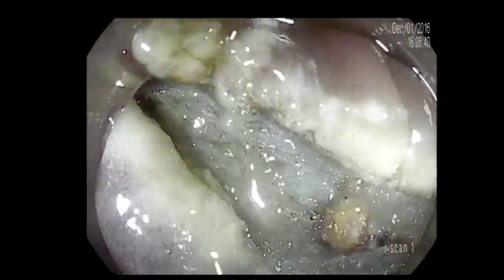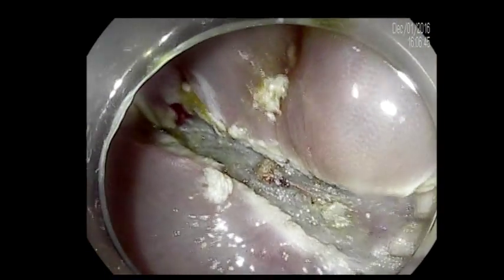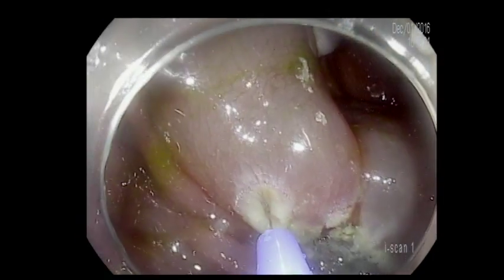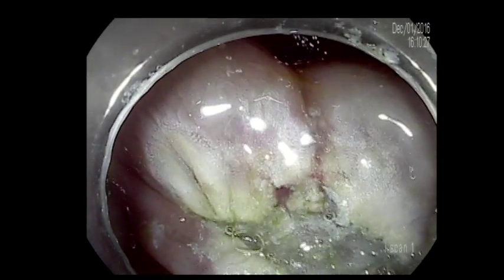After removing it, we're going to inspect the bed of the polypectomy, ensuring that there is no perforation, no blood vessels, and also there's no residual lesion.